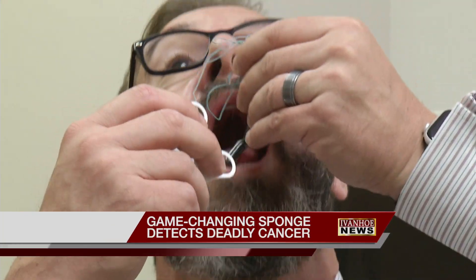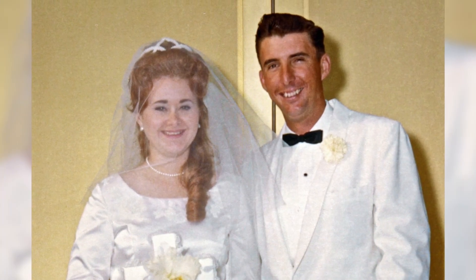Take this capsule, put it into your mouth, and then swallow it. David Brown is one of the first people in the United States to try out a new test to detect a very dangerous cancer — a cancer that claimed his dad's life.